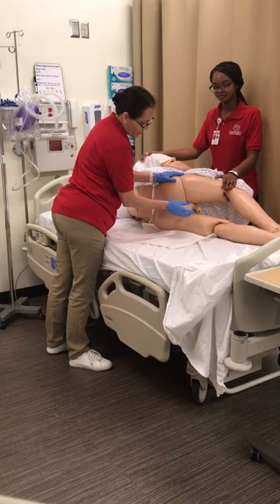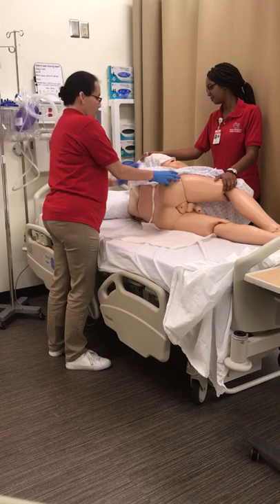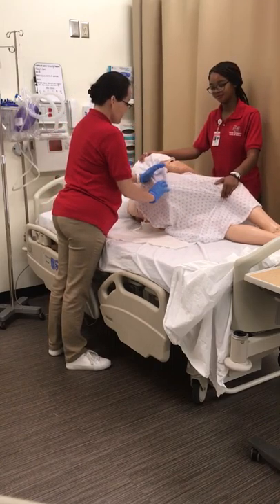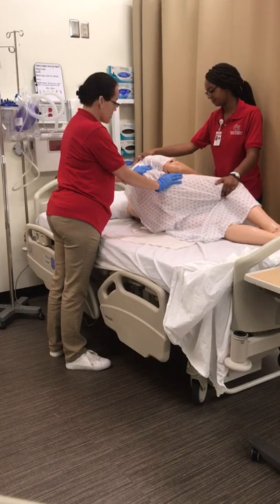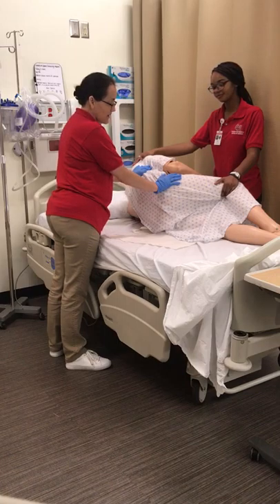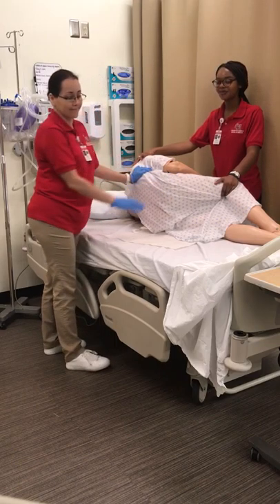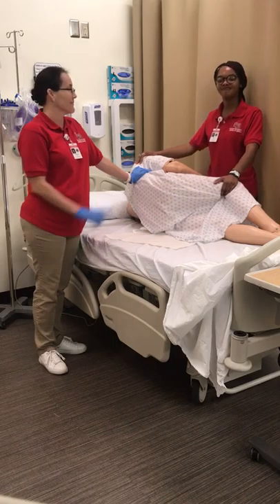After administering the full volume, remove the tip and ask the patient to hold it as long as possible — the package says about ten minutes. Stay in this position and remain with the patient, making sure they're comfortable until they need to defecate. Then assist them to the bedside commode, bedpan, or toilet. Dispose of all materials according to hospital protocol.